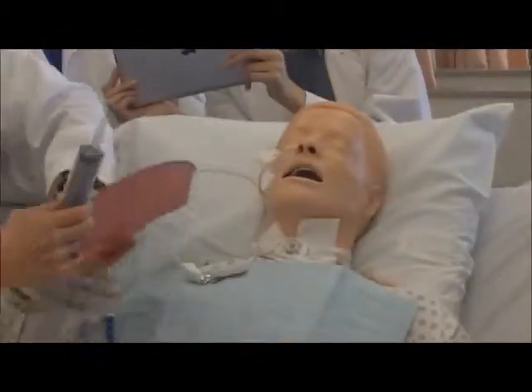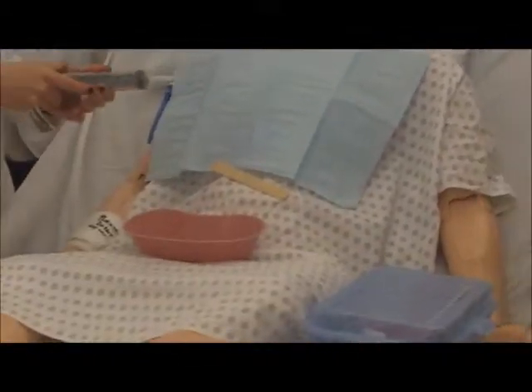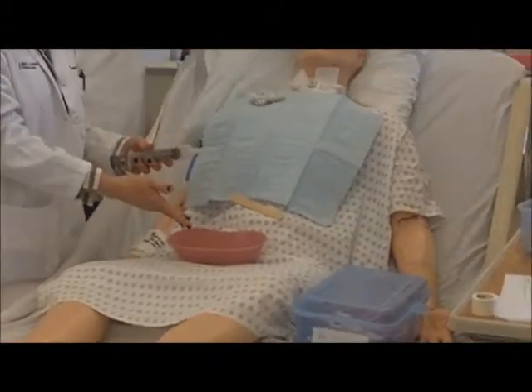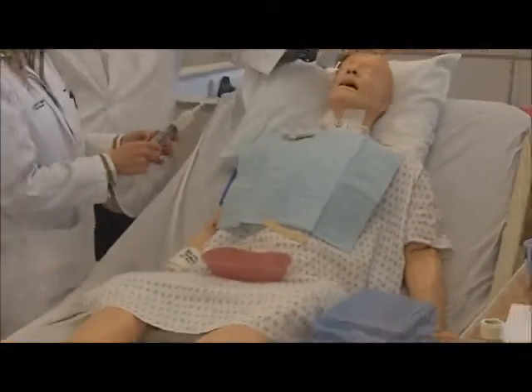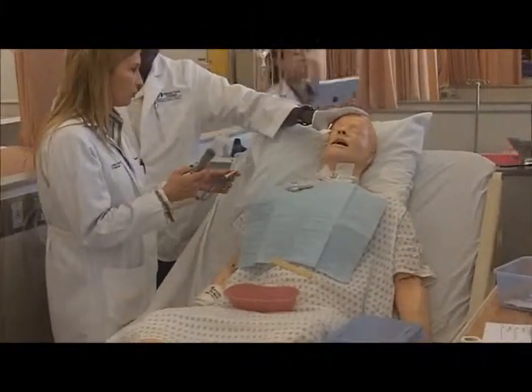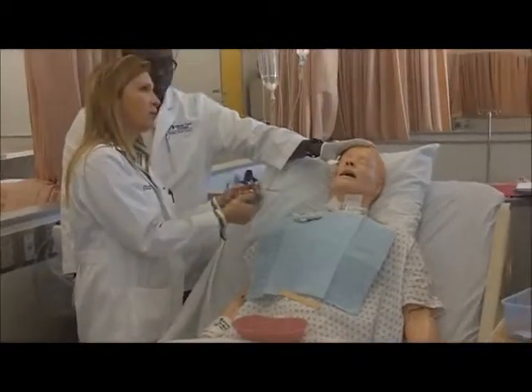You want to have this on the patient, just stick this on the patient for when you're doing your return demonstration, that way I know that if he vomits, I have something to catch it in. About 30 to 40 cc's of fluid for placement. You'll need to take the clamp off if you clamped it prior to.